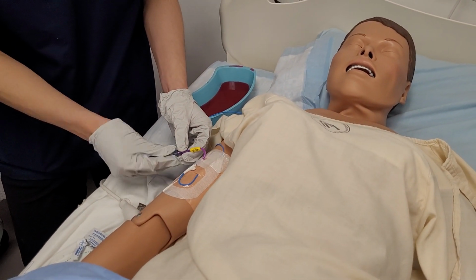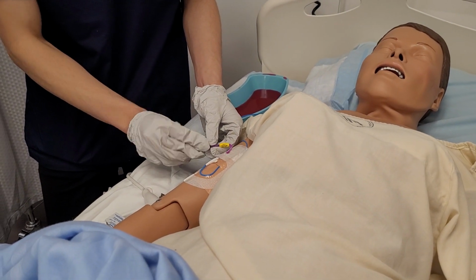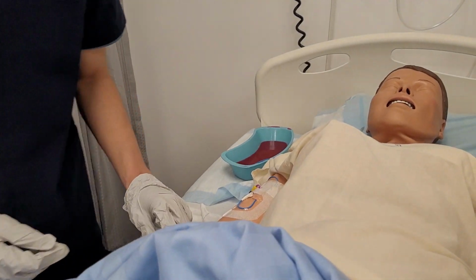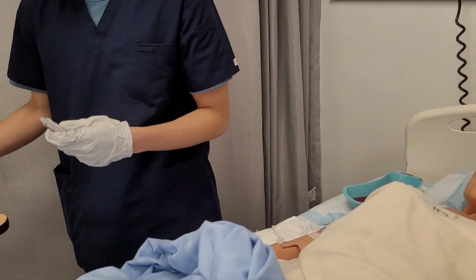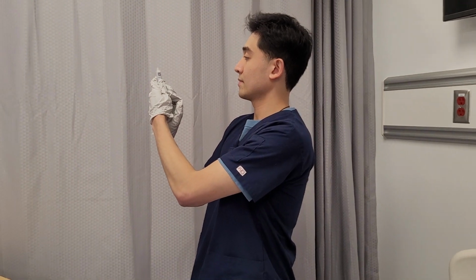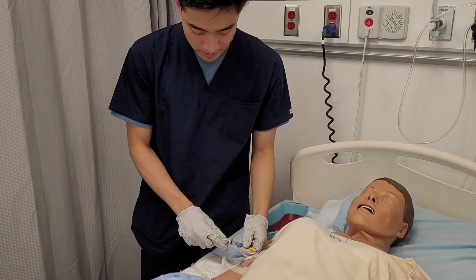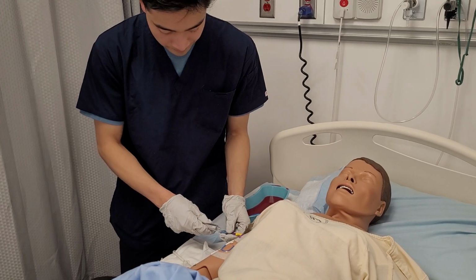So let's go this way. And if you have any questions, comments, or concerns, just let me know. Alright, so I'm going to prime my normal saline syringe. Alright, Pat, this shouldn't hurt at all, but if you feel any discomfort, again, just let me know.